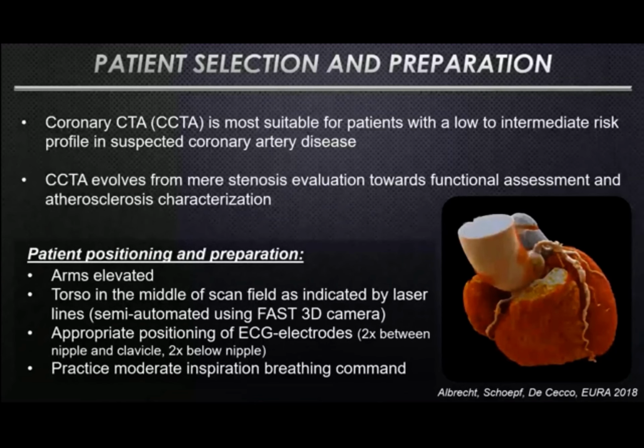First, some consideration about patient selection and preparation. It's important to acknowledge the fact that coronary CTA or CCTA is most suitable for patients with a low to intermediate risk profile in suspected coronary artery disease. That means the main strength of this technology lies in those patients. If you have patients with high likelihood and severe calcium burden, for instance on your calcium score acquisition, then it may be more appropriate in those patients to go directly to the cath lab and perform invasive catheter angiography.